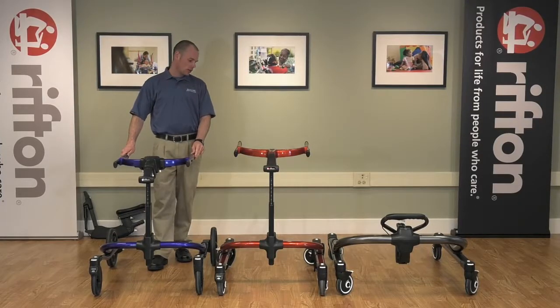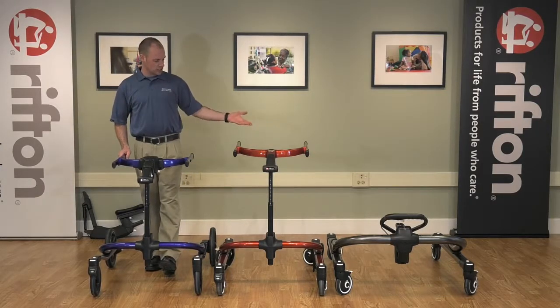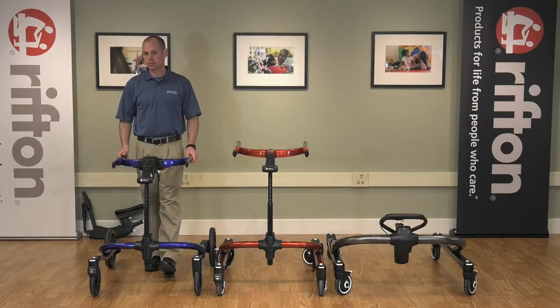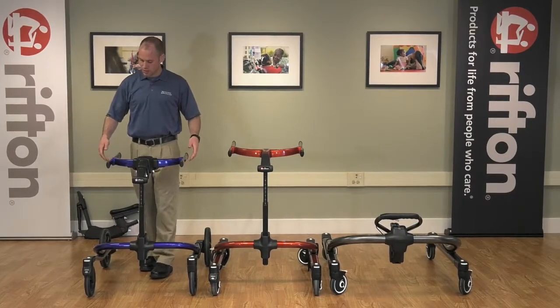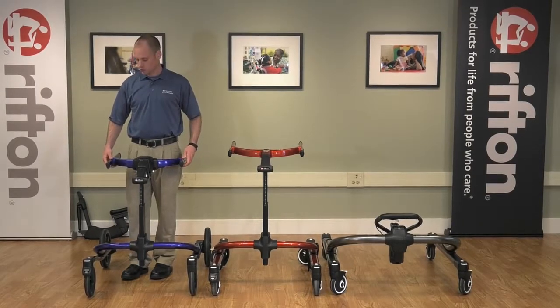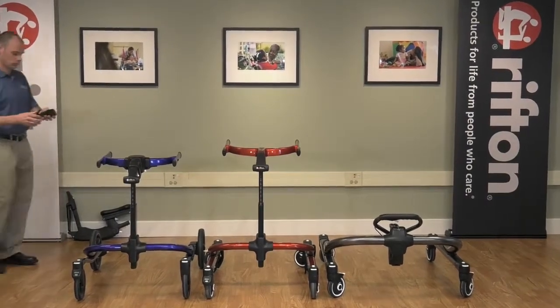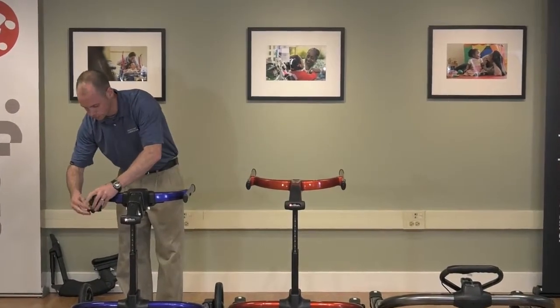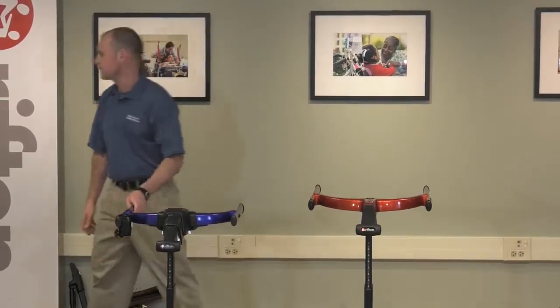You will need to get the appropriate ankle prompt for the base, as the bases are all different designs. So you'll need a treadmill base ankle prompt, or a utility base ankle prompt, or a standard base ankle prompt. Those are not compatible with the old. However, as you can see here, we have two bars on the side of the pacer upper, which allow for the same clamps we used before to be put on. So I'm just going to show you how that would work. So it's the same clamp here, and it clamps onto this bar here. And one of the new developments we have is a new style of communication tray.